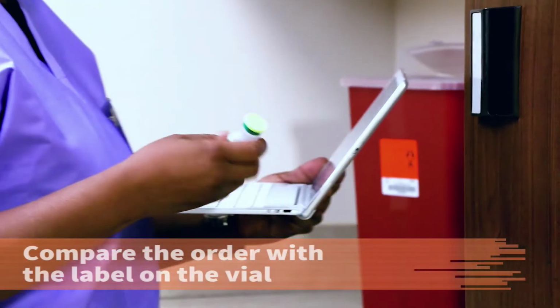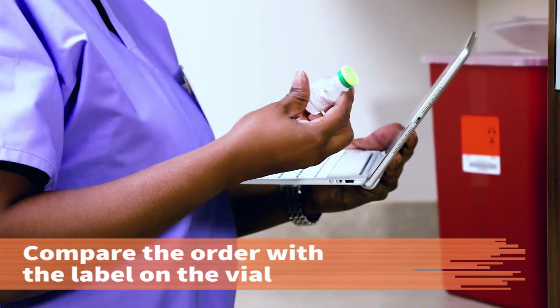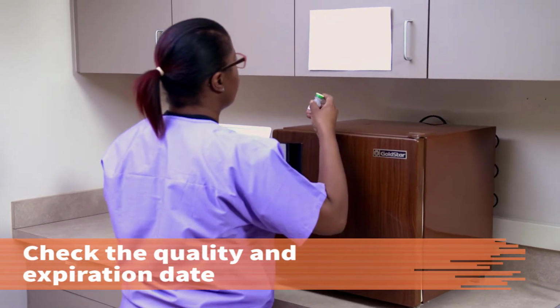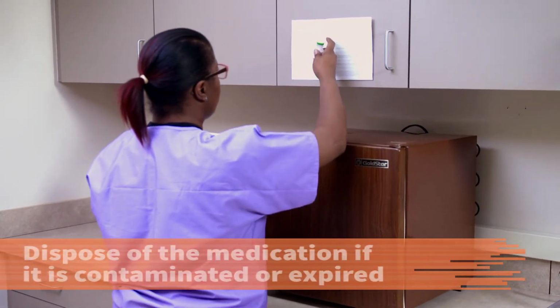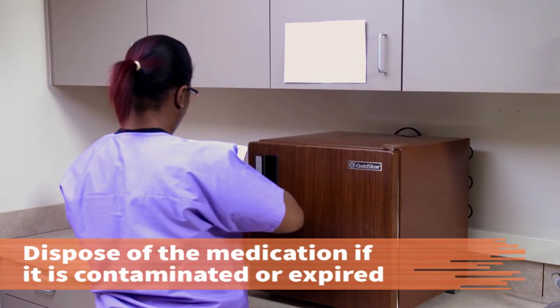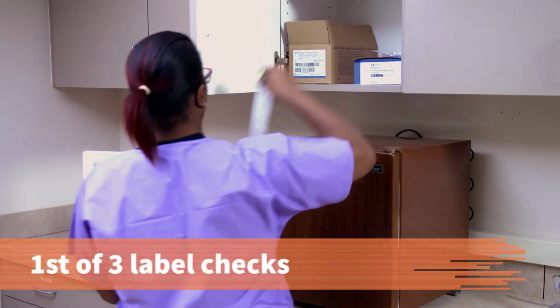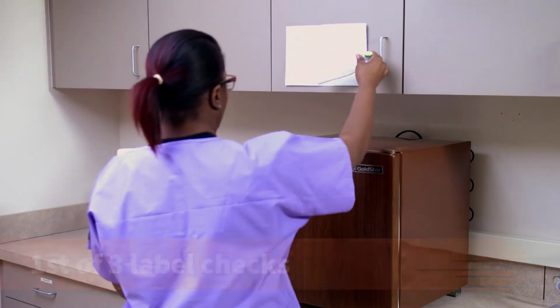Compare the order with the label on the vial of medication when you remove it from storage. Check the quality of the medication and the expiration date on the container, and dispose of the medication if it appears contaminated, contains sediment, or has expired. This is the first of 3 label checks.